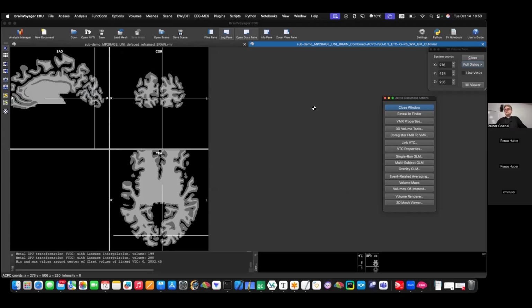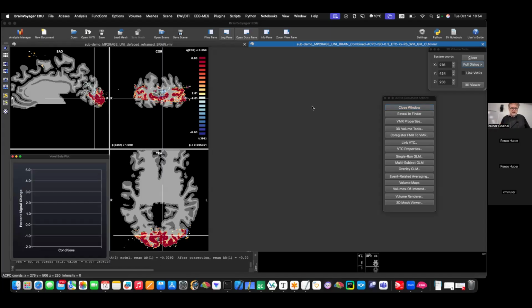Yesterday I did the VASO. I showed you the blue colored voxels because I didn't flip the data, which you can. But now we get BOLD, so we should get a lot of red colored things like before, but now in our 300 micron space. So it's already done. You see, look at the data, how strong it is. And it is extremely precisely aligned, although we had a huge transformation, right?